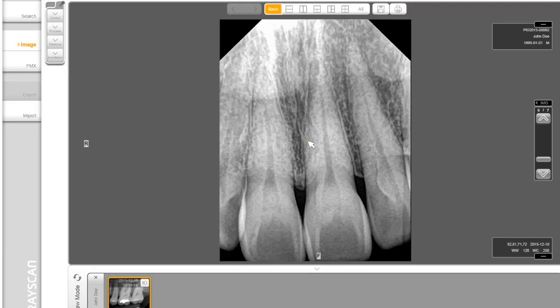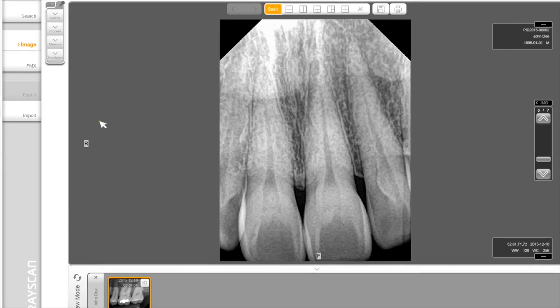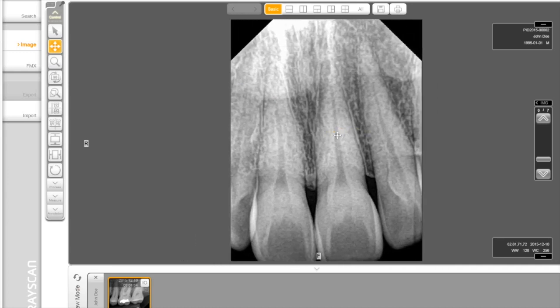Utilizing tools in RIOView. You have a series of tools on the left side. To expand or collapse any of the modules, simply click on their associated icons. If a toolbox is not in locked mode, it can be customized to display the desired toolbox option. In the top corner, you have tools in different sections. The first section is the Basic Control Manipulation Tool. If you single left-click on Move, this allows you to move the image.